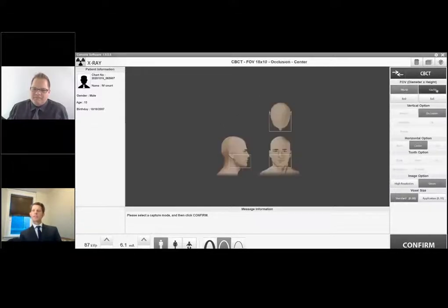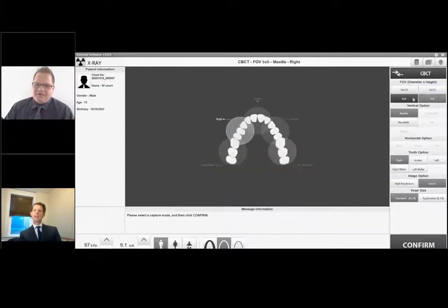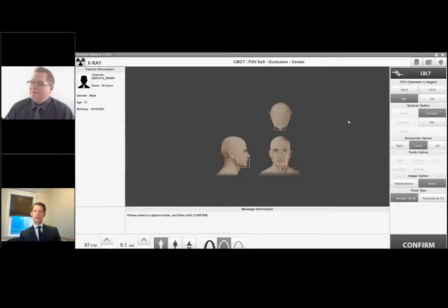Paul, let's talk about the scan times on our CT. This is one highlight of the Vatech device, and we're going to be talking more about this in a little bit: patient movement and the need to make sure the patient holds still. So what are the scan times here, Paul, for the larger fields of view? So the two large ones, 18 by 10 and 13 by 10, are about a 9 to 10 second scan. And then the 8 by 9 and 5 by 5 are about 4.9 seconds. Yeah. So a really fast scan reduces the chance for patients to move.